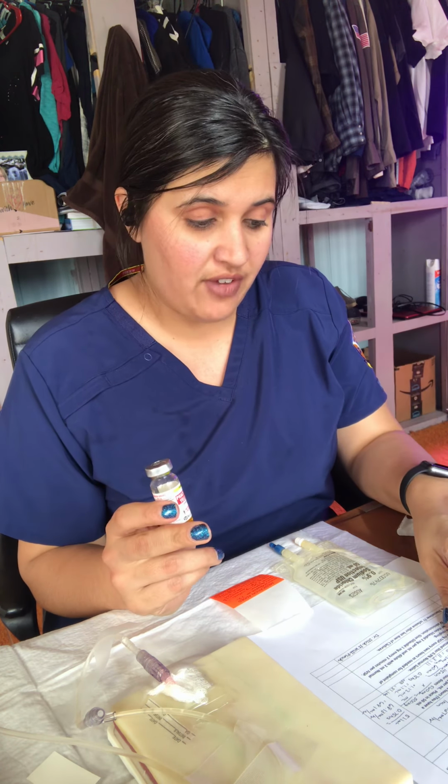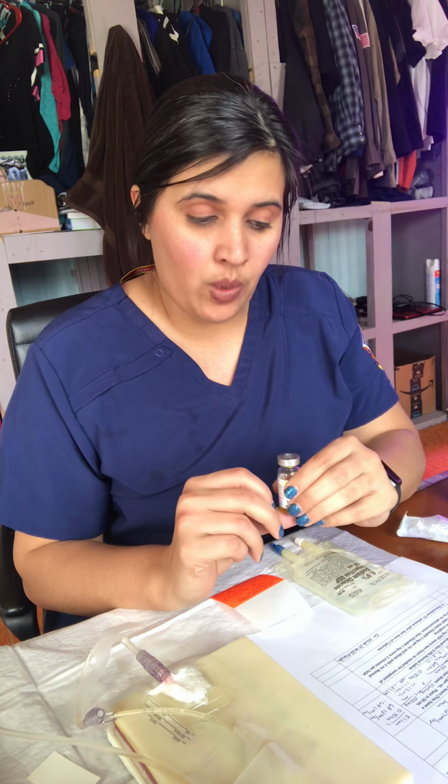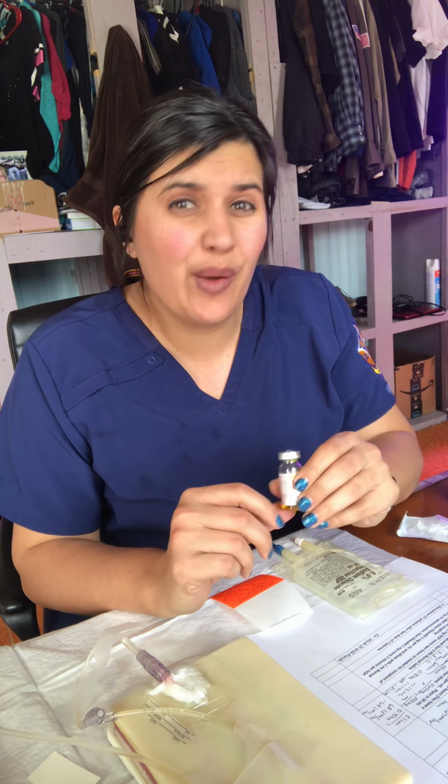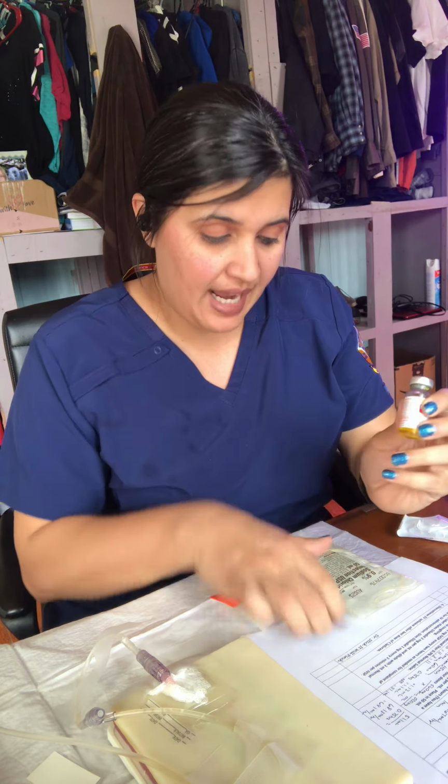The order is 560 milligrams, so that would get me 1.12 milliliters, or 1.1 milliliters, to draw up and add to my normal saline. That would give me a total volume of 51.1 milliliters.